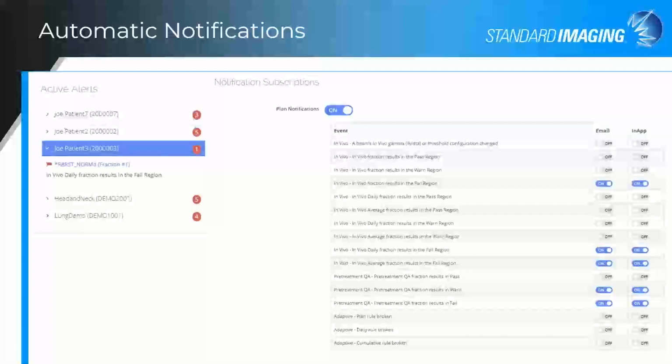It's up to you to make the software work for you, but it will definitely fit basically any workflow as far as how you want to use this, because we do have users that figure out based on their clinic what they want to be notified on, and they don't even come into the software until they get a notification. We have others that use it throughout the day. So it's very flexible, and it's based on your preferences and what your clinic policies are.